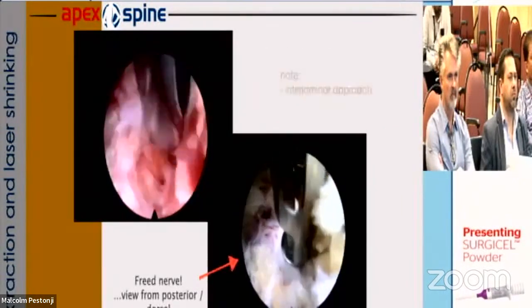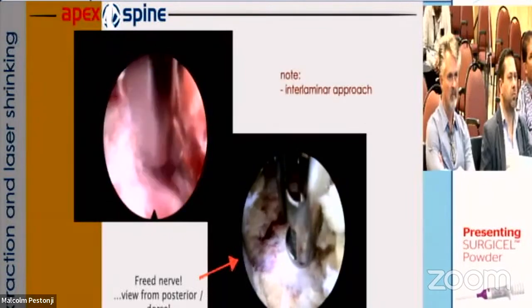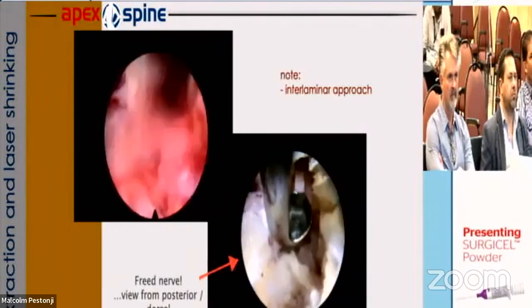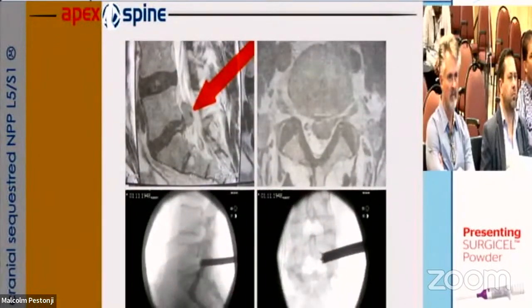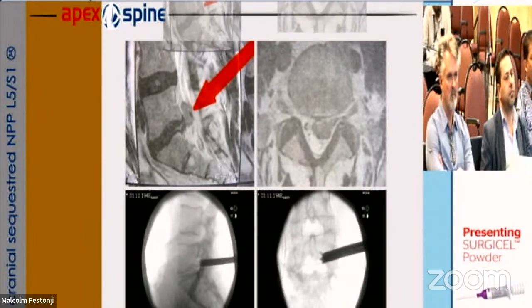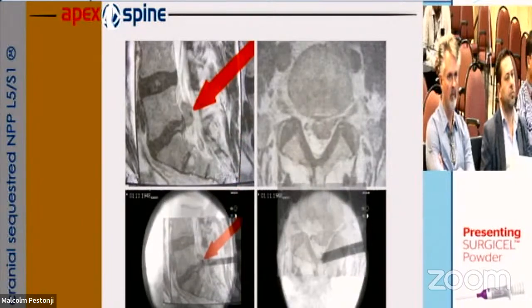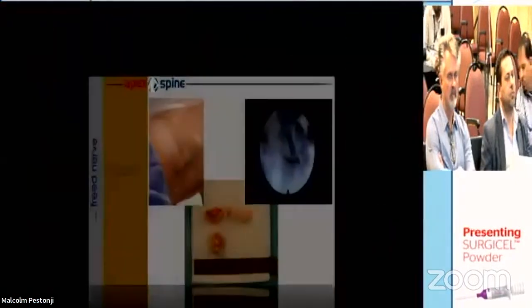And here on these pictures, you see first I removed the cyst mechanically, and then I additionally used the laser. Here another example of a cranial sequestrated disc herniation L5-S1. The approach is a little bit different. It's not that far lateral. Also here, I did not perform a transiliacal approach and I used the transforaminal approach. Again, here, nice control of the pictures.